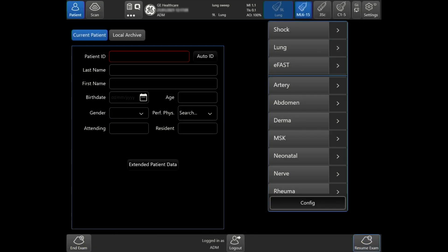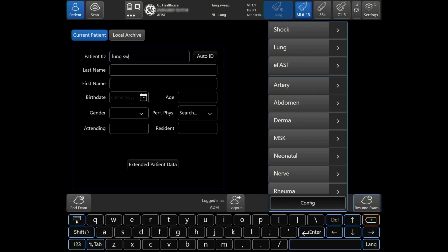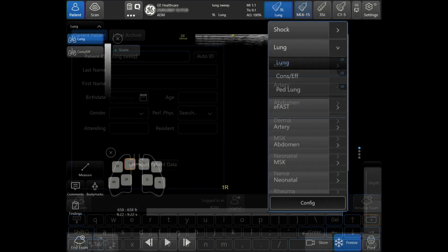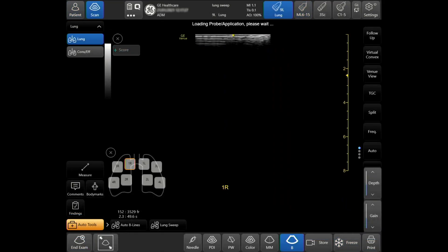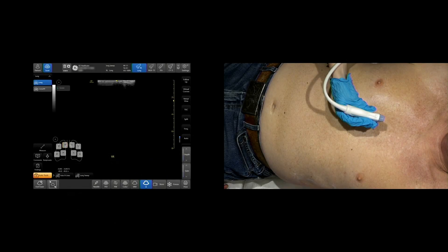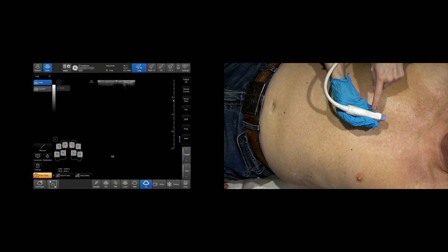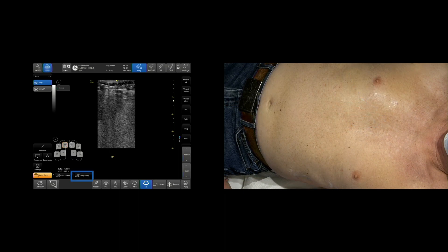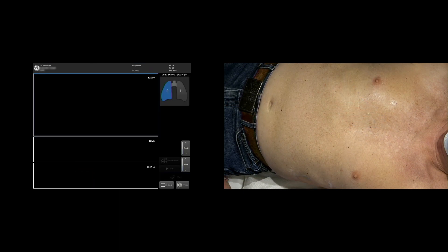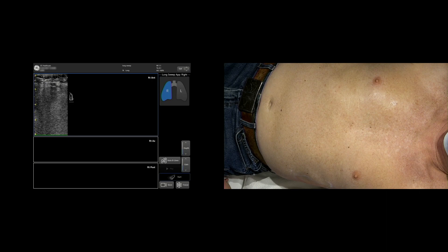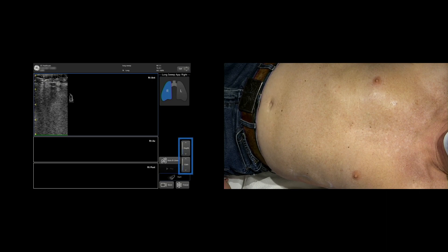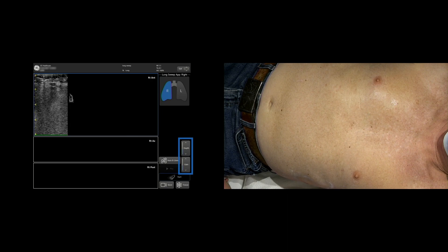Begin by entering patient information. Select the correct probe and preset. Make sure that the reference marker of the probe is pointed towards the head. Tap Lung Sweep. Before starting the sweep, optimize the lung image by changing gain and depth from within the Lung Sweep tool.